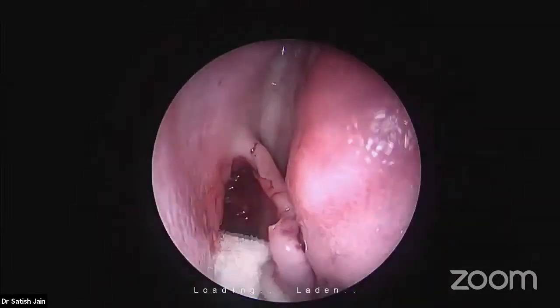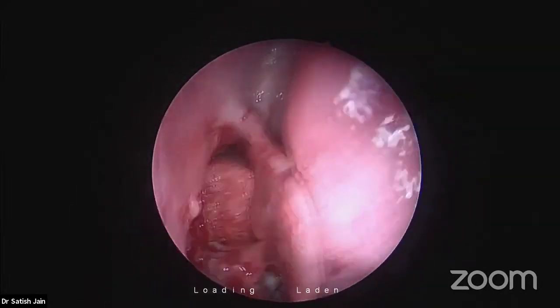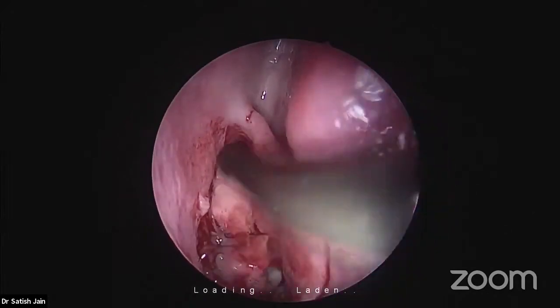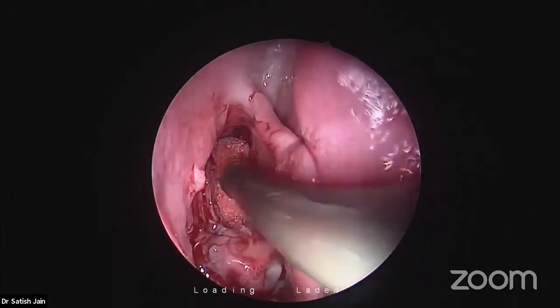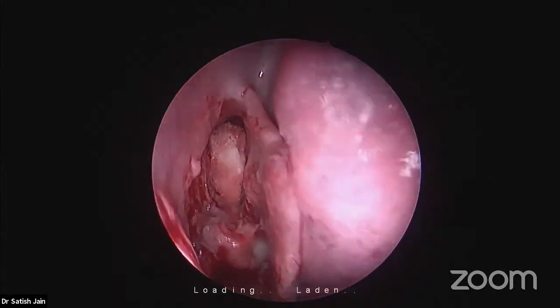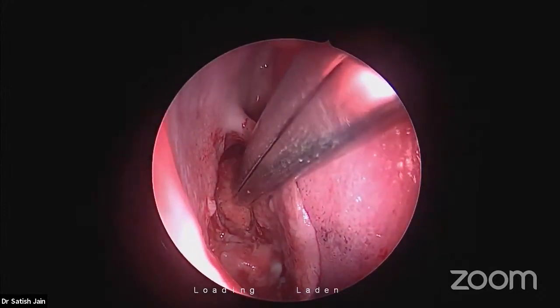Fovea means impression. What about hiatus semilunaris superioris? Could you put in a word about that? Let me show you. I showed you between the bulla and the uncinate process, that was hiatus semilunaris inferioris.